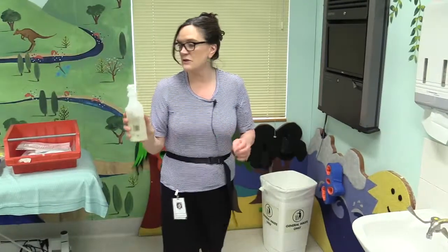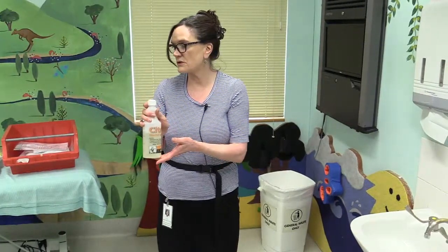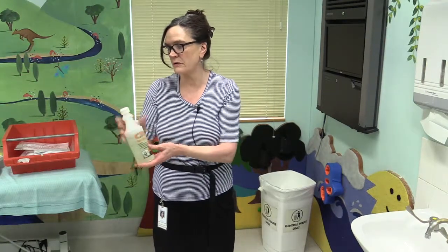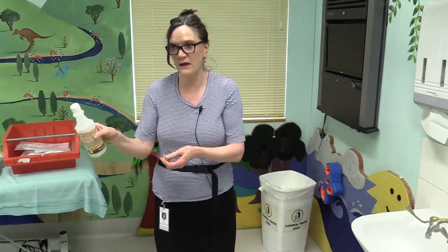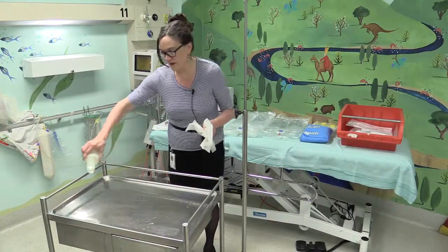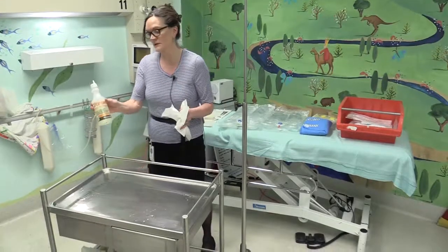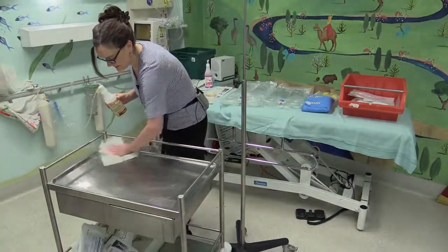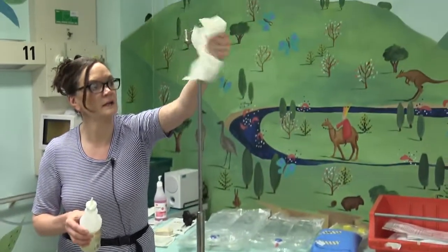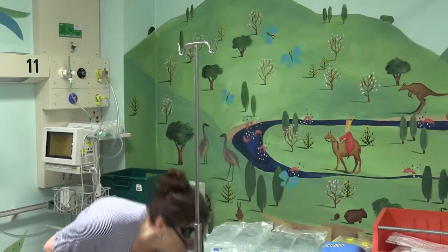So any solution can be used, detergent solution, anything you use to clean the environment in the hospital can be used to clean the area that you're going to open your dialysis equipment. I'm going to clean my trolley with cleaning solution and my pole, because I'm going to be hanging the dialysis solution there.